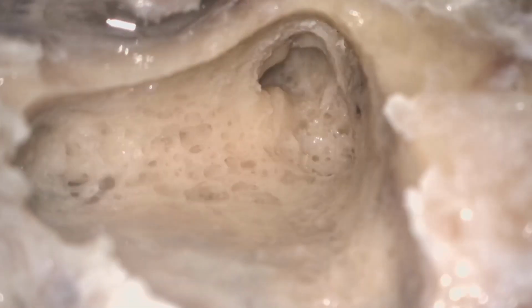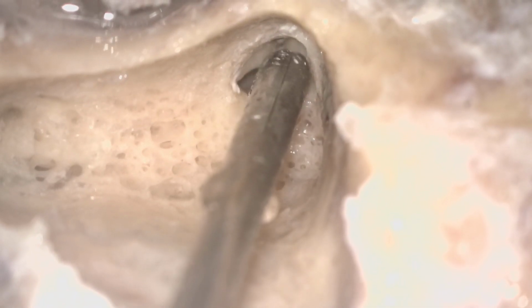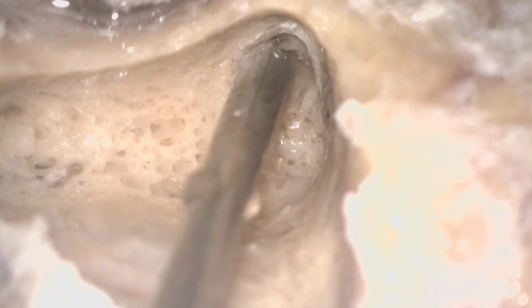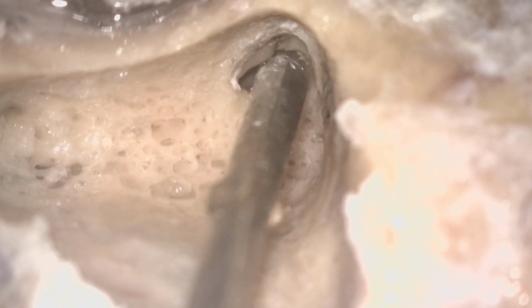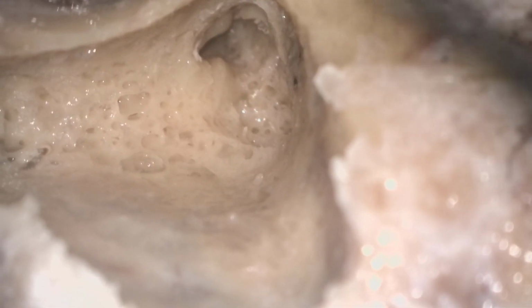Okay, so this is your superior part and this is the body of the incus. So here you will find the fossa incudis. This is the lateral semicircular canal. This is the body of the incus. This is the short process of the incus, and here the attachment is the fossa incudis. Okay, so now you have to go anterior, more anterior from that part. You have to drill that part slowly so that you can identify the incudomalleolar joint.